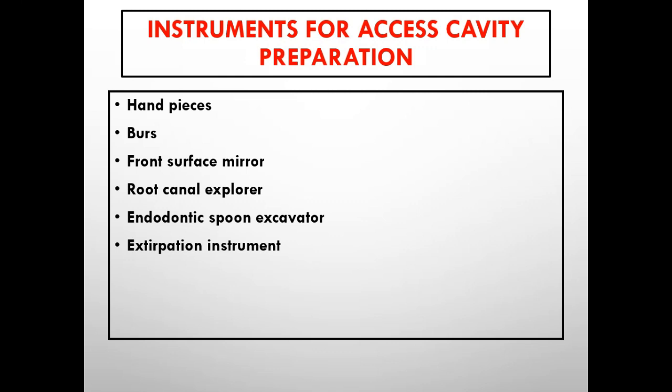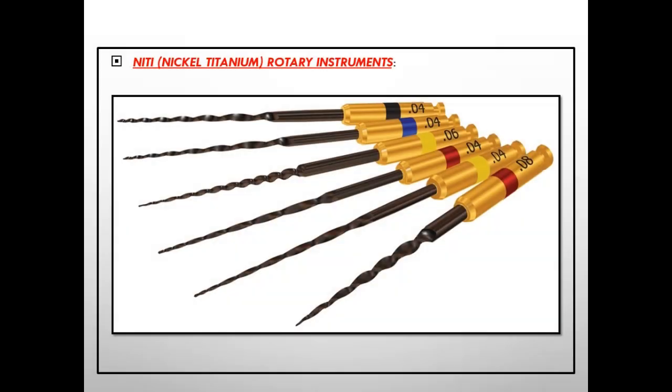One thing about the nickel titanium files: this super elastic alloy does not exhibit a proportional strain under stress until a specific level is attained, which ultimately causes the fracture. Due to their shape memory, it has led to the development of endodontic instruments which can be employed in rotary motors. Numerous types of instruments can be employed in truly rotary, 360 degree revolution in a curved canal, and it is recommended that they are used in a handpiece driven by an electric motor at 150 to 600 rpm.